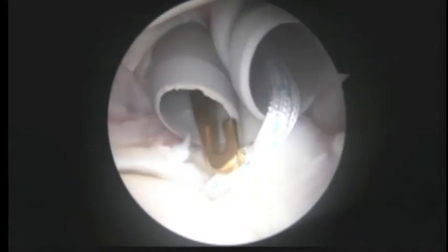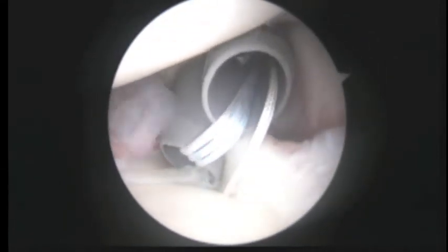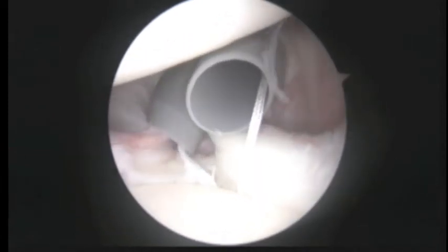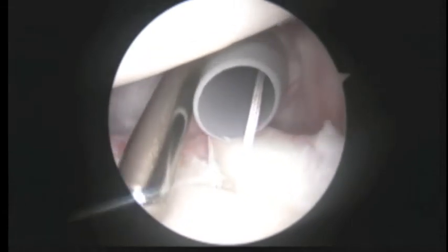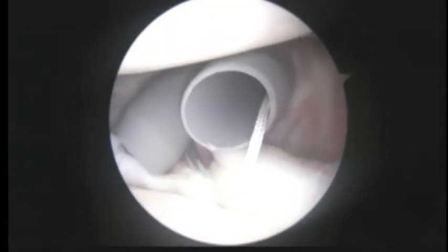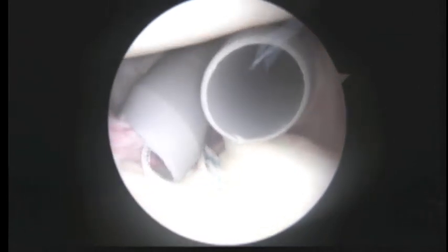So we're gonna take out the two striped sutures and one of the white sutures here. Like this, then we'll take a switching stick. Take these three sutures on the left out of the way. And then we'll reach in and take the one suture that we're gonna use first, this white one here, and bring it so it's inside the cannula on the left, like that. And so now we're gonna take this suture hook and bring that through the cannula on the right here.